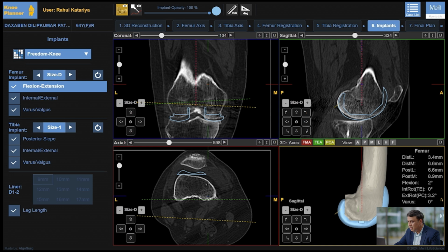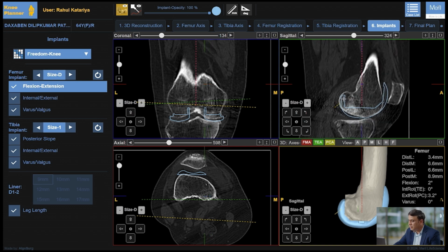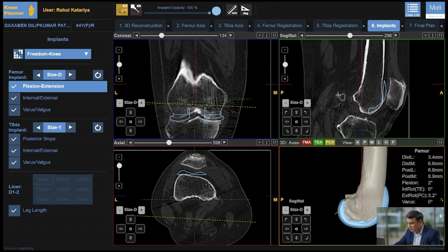So option one is match the posteromedial condylar offset, accept a millimeter or two overhang, or the implant shooting out of the posterolateral boundary, acceptable. Option 2, match the posterolateral condylar offset, maybe a millimeter or two underhang in the posteromedial condylar offset. Option 3, match both the condyles, medial and lateral condyles. Any of the three options can be seen.